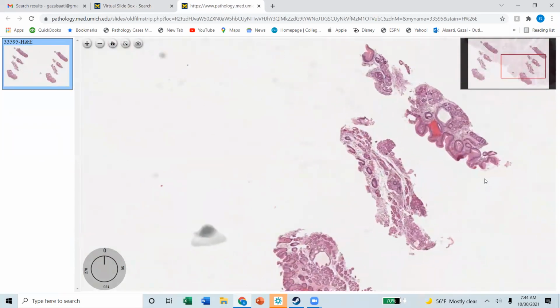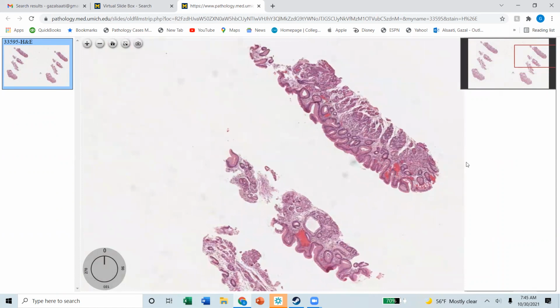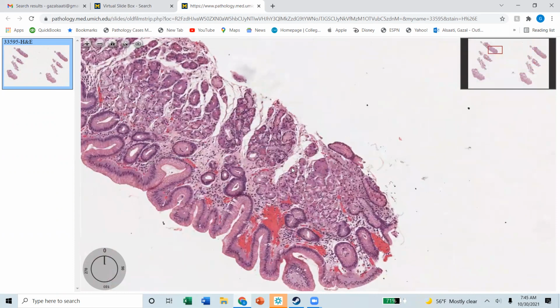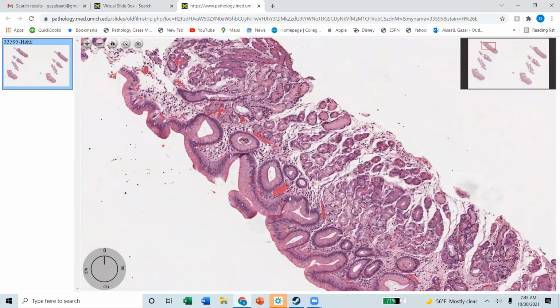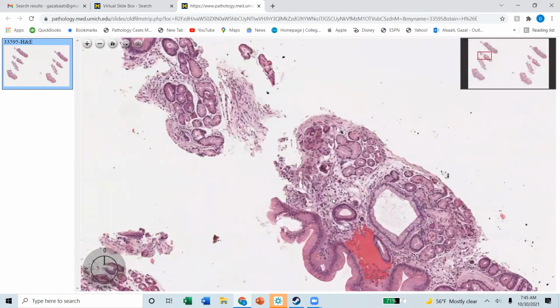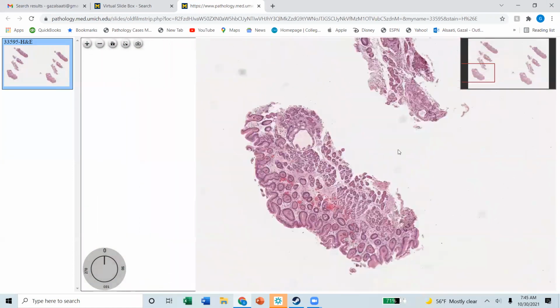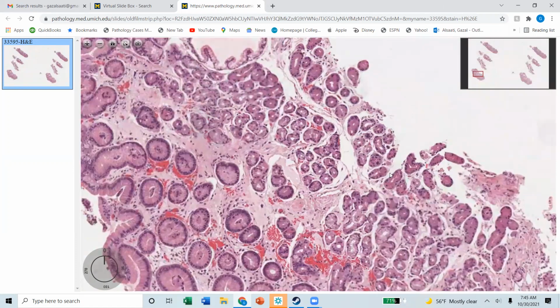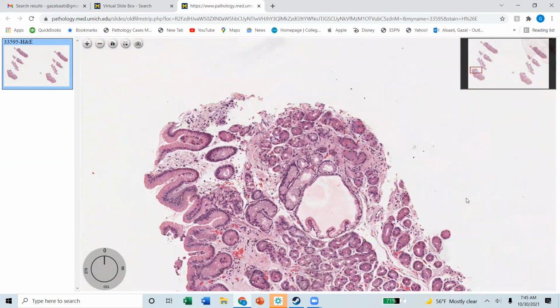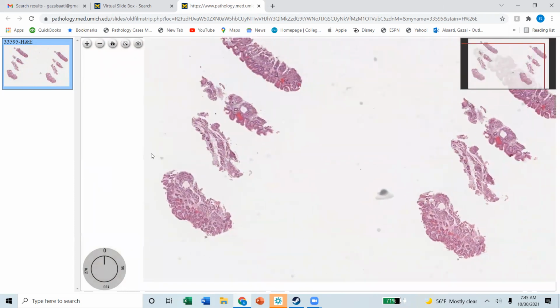Just to let you know, when I started working, in a couple of cases I used to call it in my description, pancreatic acinar cell metaplasia, and I received a lot of phone calls from the clinicians, so I stopped saying that. They would ask, okay, so what is this? This is cancer? Is it metastatic pancreas? What do I do? I'm like, no. Especially at the GE junction, it's not something that is fun to mention. And by the way, it's very common at the GE junction.